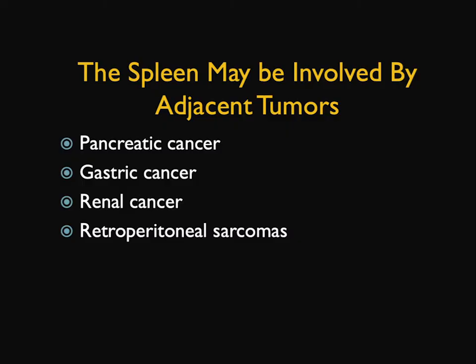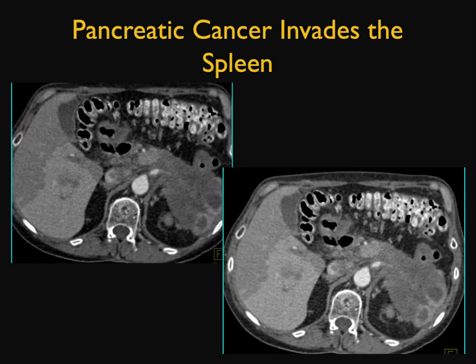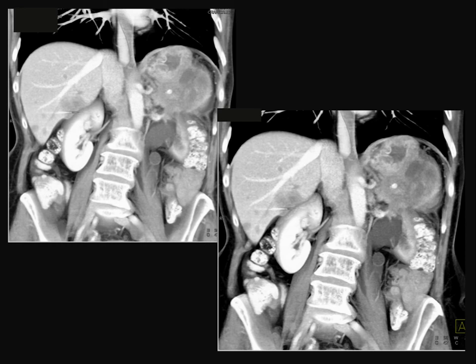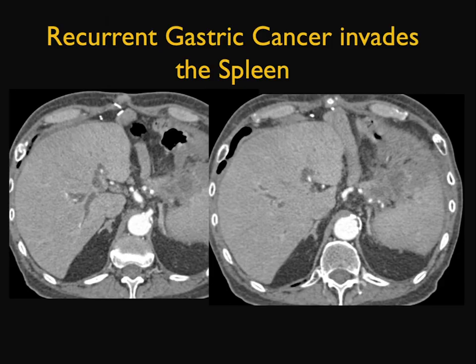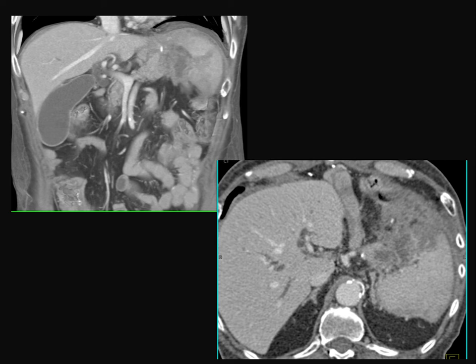Direct extension — and of course the classic thing is pancreatic cancer. Tail of the pancreas tumors invade the spleen, but that does not make the patient unresectable because patients with distal pancreatic tumors can get a distal pancreatectomy and splenectomy. So splenic involvement is important but does not make somebody unresectable. Here you see direct extension and infiltration, and unfortunately there's also significant vascular involvement and involvement of the crus of the left hemidiaphragm. Here's a patient with recurrent gastric cancer showing implants on the splenic surface — tumors that are local like gastric cancer can invade the spleen when they recur.